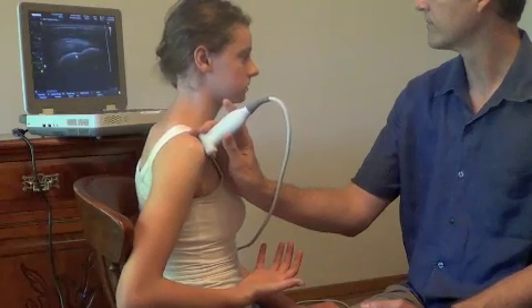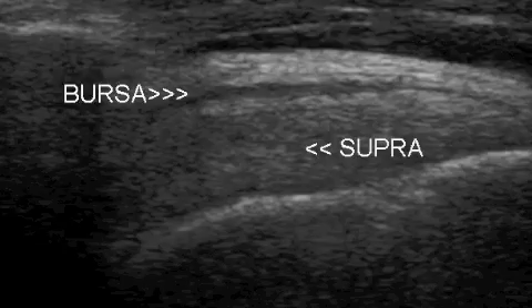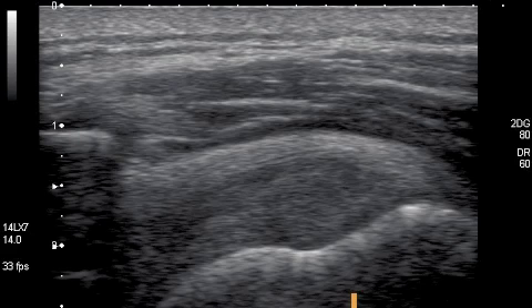Then turn the probe 90 degrees and scan the tendon in a longitudinal view. Look to see if the fibres are intact and uniform to suggest a normal tendon. If fibres are more hypoechoic and the tendon is thicker, it is showing signs of tendinosis.